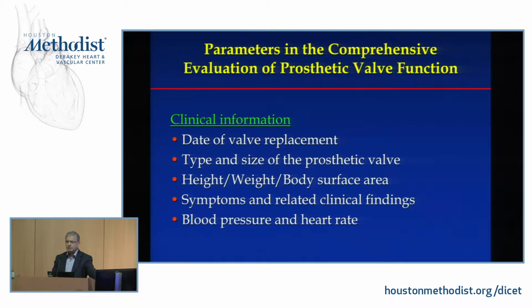And remember, for body surface area, unfortunately, because of the obesity epidemic, whenever you start thinking about prosthesis-patient mismatch, if you divide by a large number, you'll make most of these valves prosthetic mismatch, and it's not.